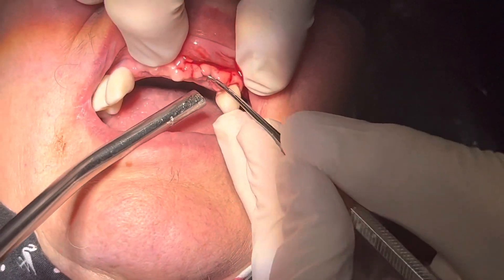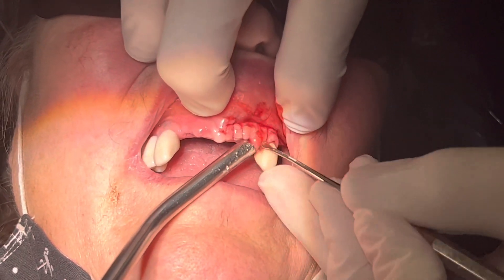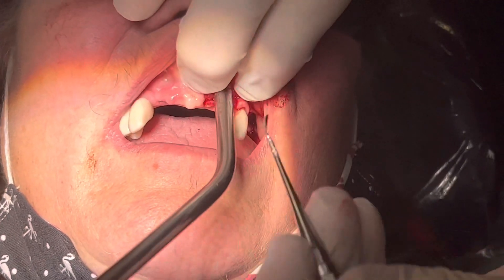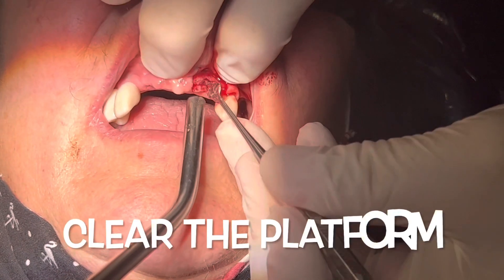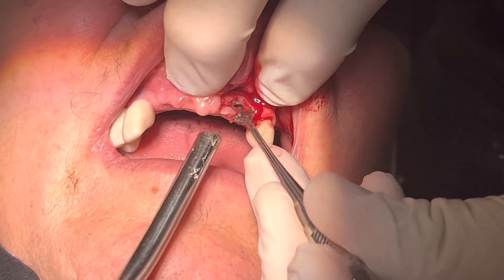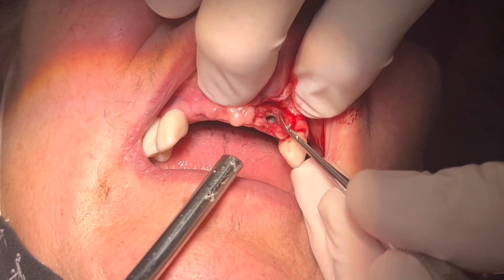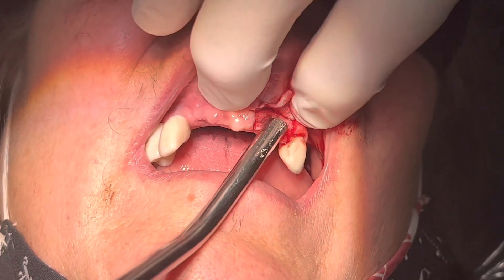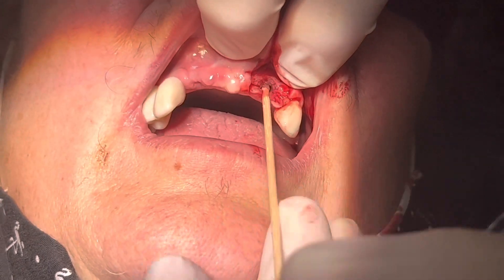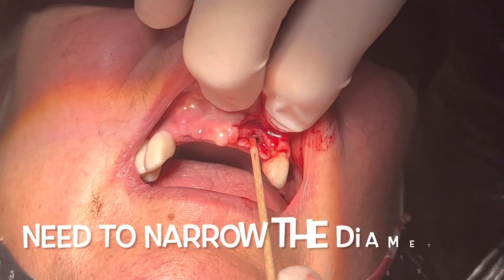I bought this molt from salvin.com — these are great tools for elevating tissue off the bone. The tissue feels a little bit fried but not too bad. We'll go in and clean the top of the implant; she's lost a little bit of bone around this, which is typically what I'll see around a non-platform-shifted type of approach. She doesn't have any teeth behind the canine to support her occlusion, so the pressure is coming on the lateral aspect of the bridge and the screw is the only thing holding it.